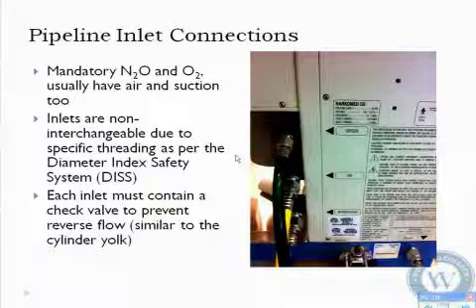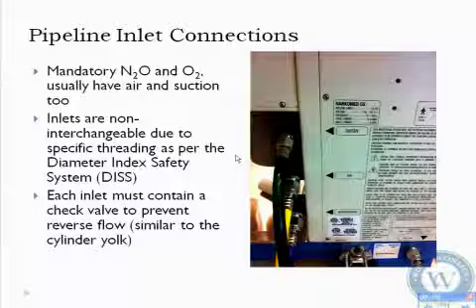Okay, so those should always correlate. Some ORs, when you walk in, you're going to see a digital readout and no longer see these analog pressures. All right, it's just going to be a digital readout.